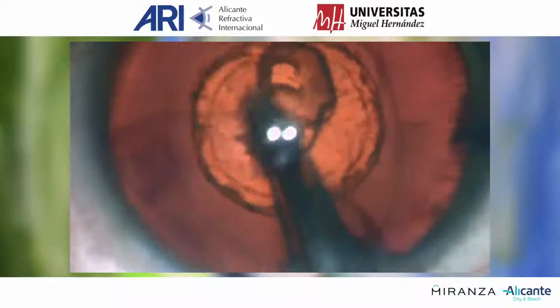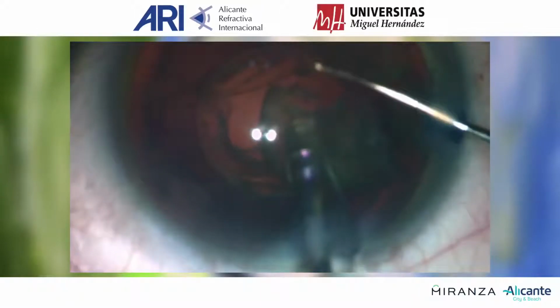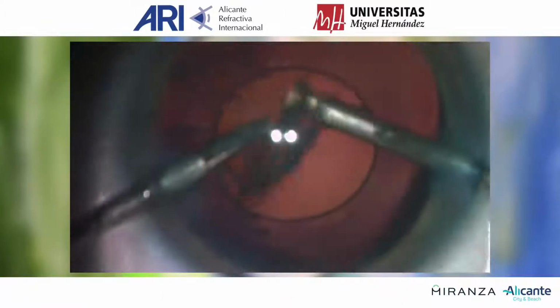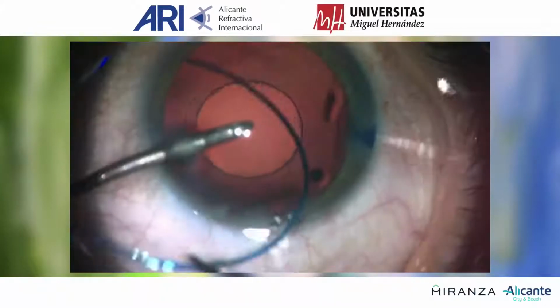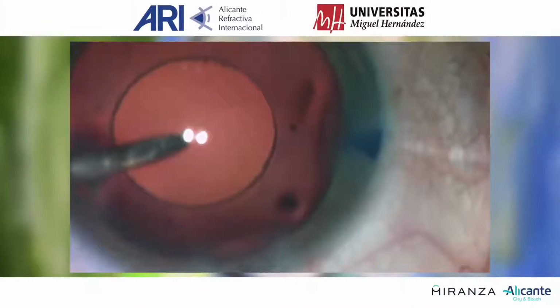The central capsular disc is aspirated directly by the phaco tip. The cataract is removed through the capsulotomy with the blue stained edge, which increases its visibility. The pressure of the capsular tension ring over the capsulotomy edge demonstrates its reliability and strength.